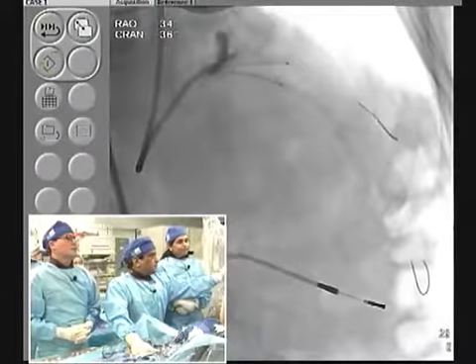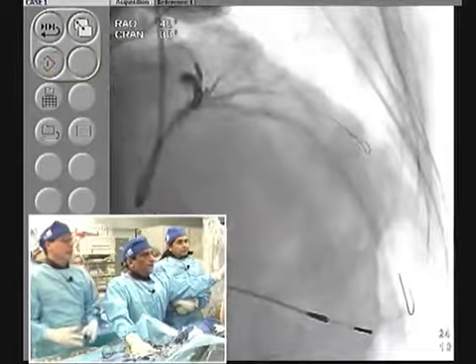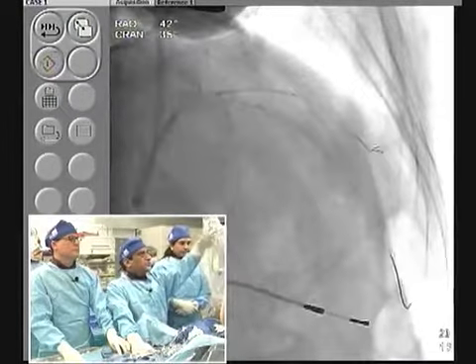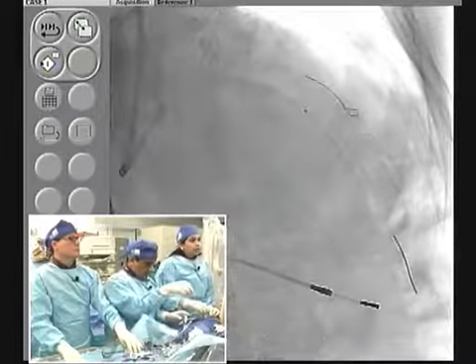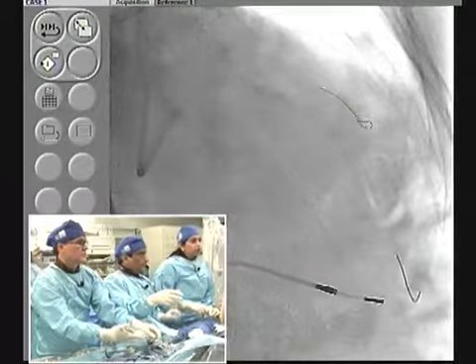Now, the question also comes that distal LAD, do you want to do a little massage? Because it looks like there is a vertical displacement of some of the plaque after that. Although I think it looks very good. I would leave it alone. I haven't still seen how the diagonal looks in the mid portion. I think that should have been covered very nicely also.